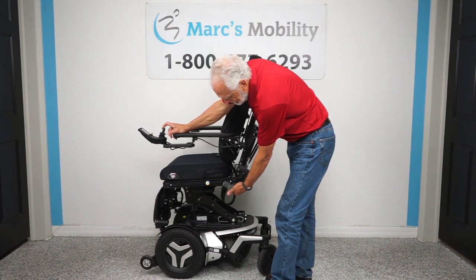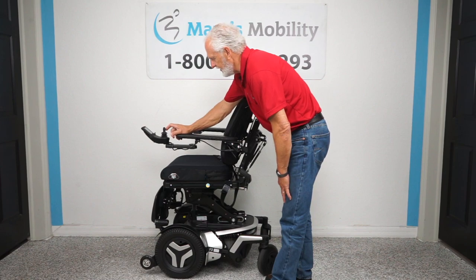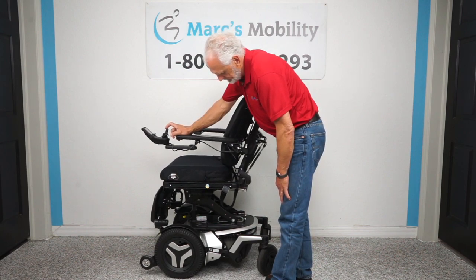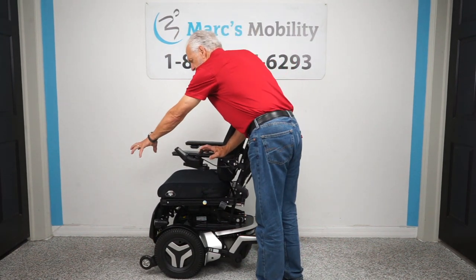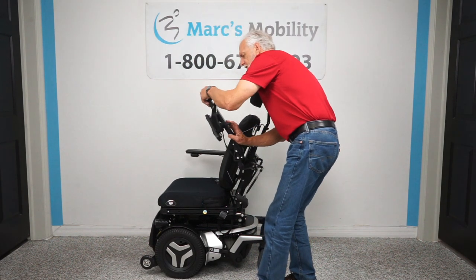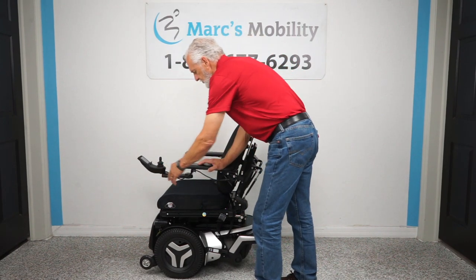Now I'm coming back down to flat and I'll bring the seat back down. While the seat's going down, let me talk about the joystick. The joystick has a swing-away feature — I moved it from here to here. This enables you to get a lot closer to your dining table without having to raise the arm and maneuver the chair. That's called a swing-away joystick.